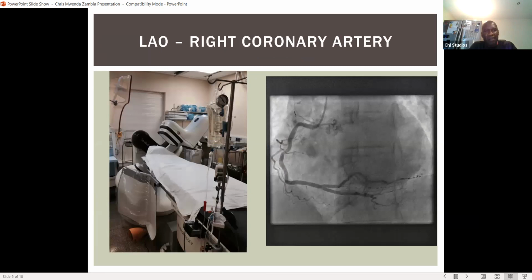One of our labs in the Wigging Show Hospital. You can see this is the GE, it is a very good equipment. It's got very nice radiation doses, very low. At the bottom there, you can see the X-ray, and that's the image intensifier. Obviously, we'll discuss in the next year. I'll try to squeeze in the radiation protection.